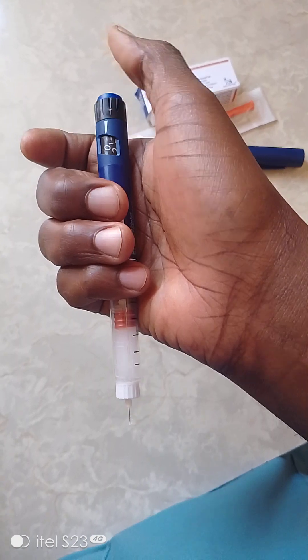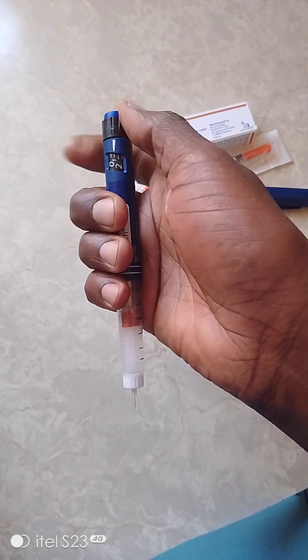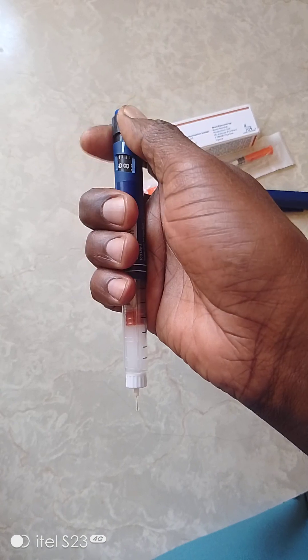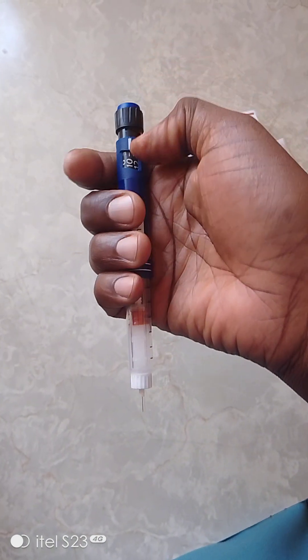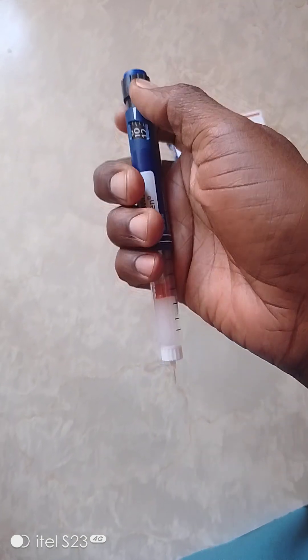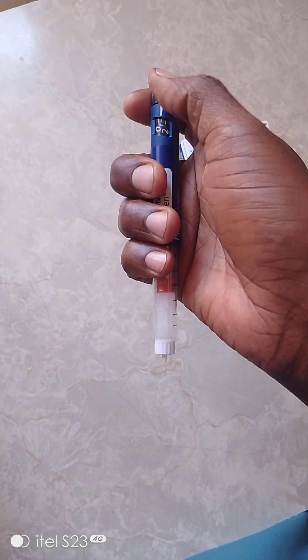As that happens, the counter goes to zero, meaning the required dose has been injected. Patients will find it easy because they just have to set what has been prescribed. If it's 10 units in the evening, you just go to 10 units and jab by pressing there. You don't need to stress about how much to inject.